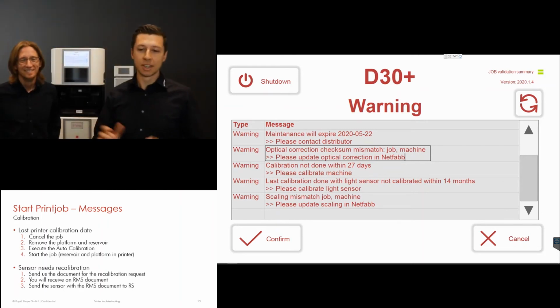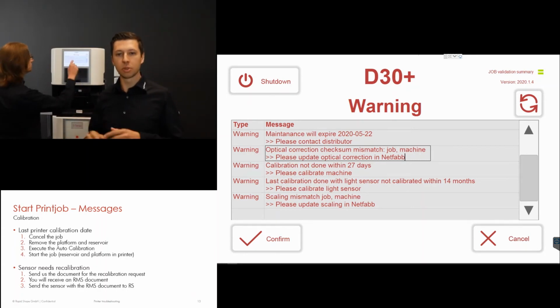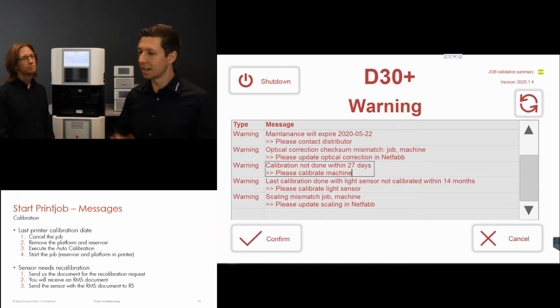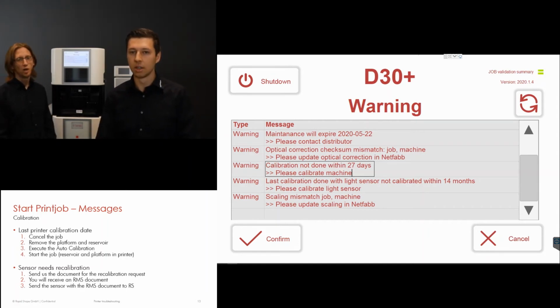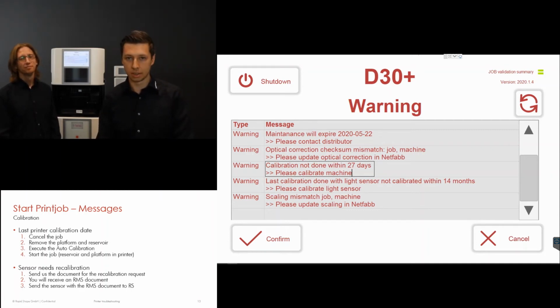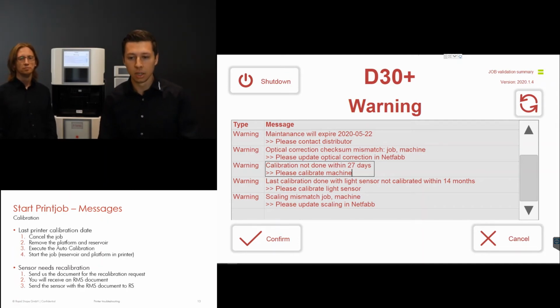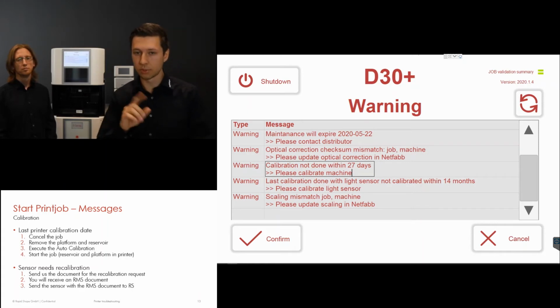Yes. So this is the topic we talked about before, the calibration. It now shows, before the print job is started, what's up with the calibration of the printer. For example, what's the last calibration date? Maybe we can see it in here. Calibration was not done within 27 days. On our machine, this is now a warning. On the Straumann machines, this would be an error. So it's pretty important that you cancel the job. With Straumann, you cannot even start it, so you have to cancel. Remove the platform reservoir and execute the auto calibration. We will do this right away, but first we have a look at the next message.